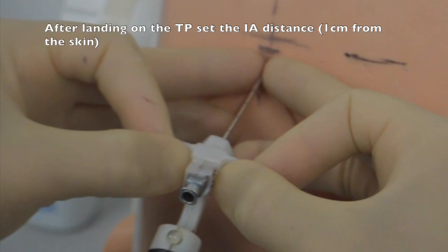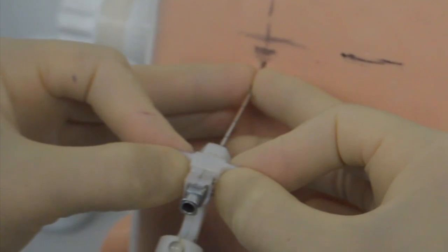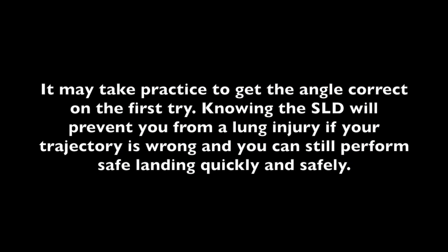After landing on the TP, set the initial advancement distance about 1 cm from the skin. It is not uncommon for novices to have trouble setting the correct angle — the seesaw principle helps with this task. It may take practice to get the angle correct on the first try. Knowing the SLD will prevent a lung injury if your trajectory is wrong, and you can still perform safe landing quickly and safely.